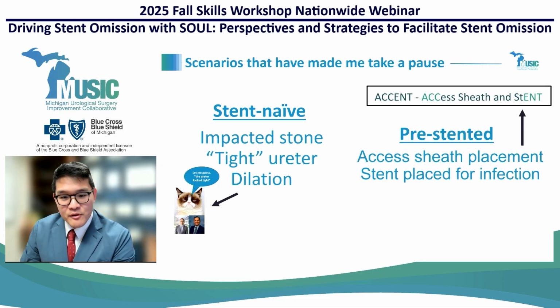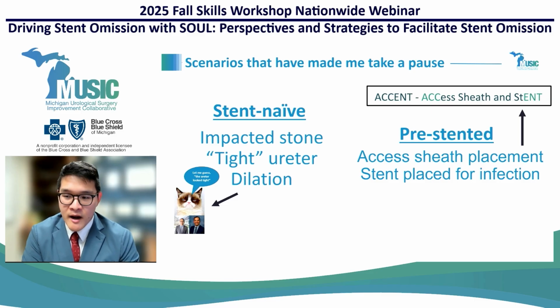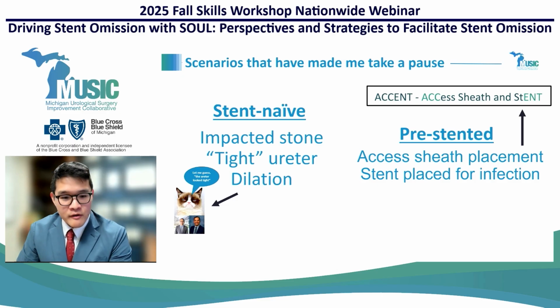And then in the pre-stented population, this is easier. But even now when we're putting a sheath up, oftentimes I don't put in a stent afterwards. And we have a randomized trial out now on that we're accruing for.